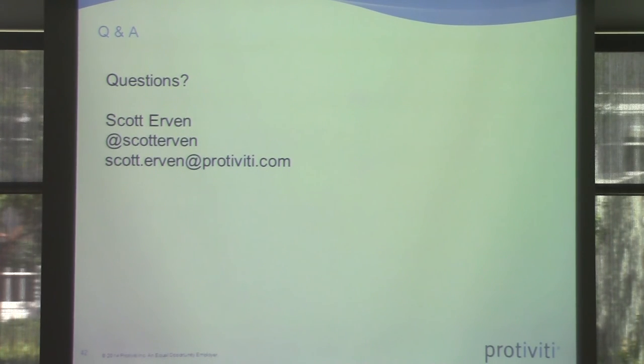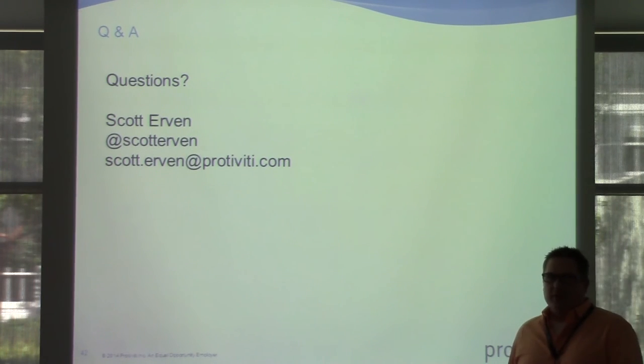But a lot of it's done unencrypted, just over port 80, and it's pumping data down. Using someone's kit that they're selling on the internet, you can man-in-the-middle it, and once you get all of the parameters out, you can just force data down into the medical record. Once you know the UIDs for the actual patient record and those types of things, that's easier.